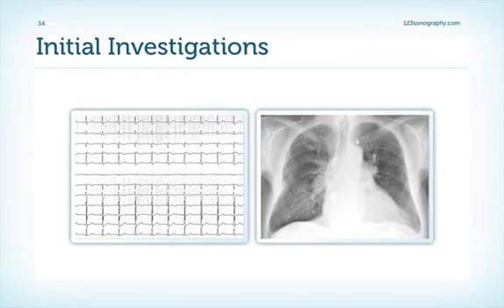They're both widely available and certainly not expensive investigations. Right ventricular hypertrophy on ECG is present in about 87% and right axis deviation in 79% of patients with idiopathic pulmonary arterial hypertension. Unfortunately, the absence of these findings does not exclude the presence of significant pulmonary hypertension, and so ECG is unfortunately an insufficient screening tool.